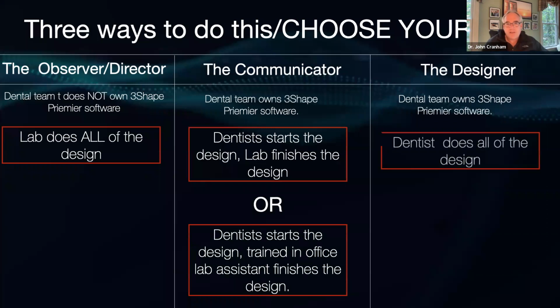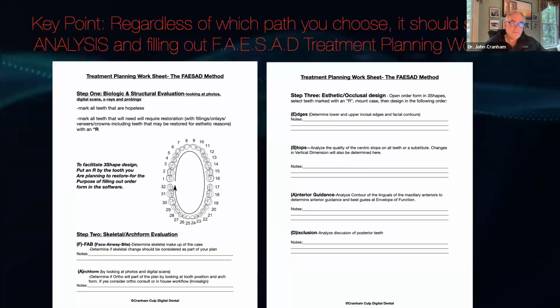And the last possibility, the way I work with it, is the dentist does all the design. And I have the time, so I enjoy doing it. I feel like I've done the case, but again, in the analog world, I did that too. And so I get that not everybody wants to do that. The benefit is you've got some choices here. And if you decide to get some training from us, we'll kind of take you through a process to figure out which is the best fit for you.